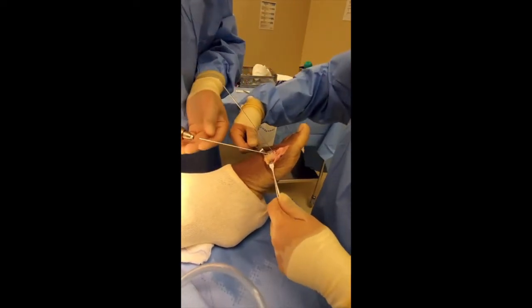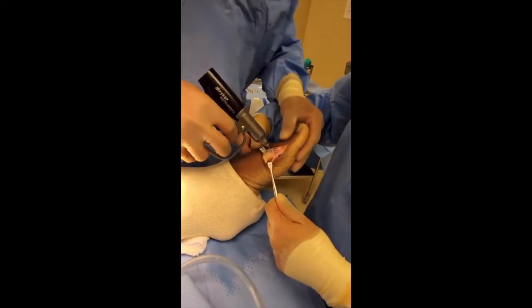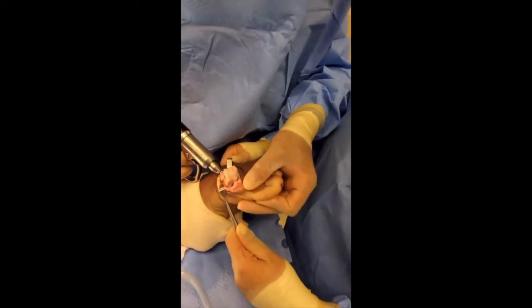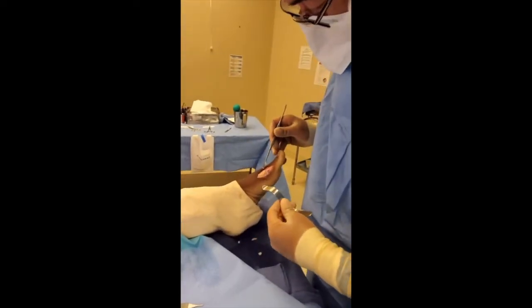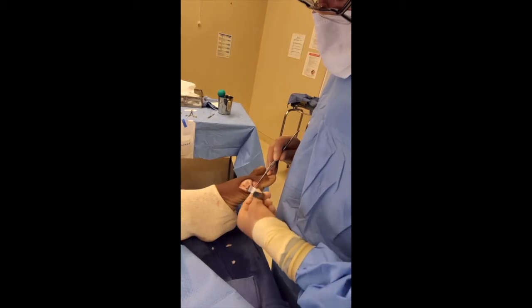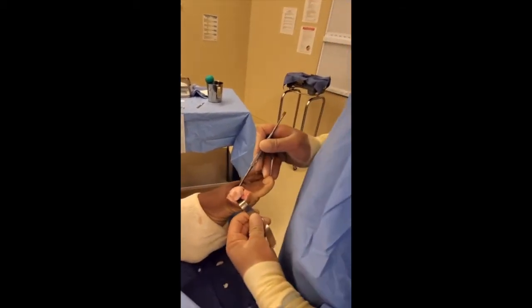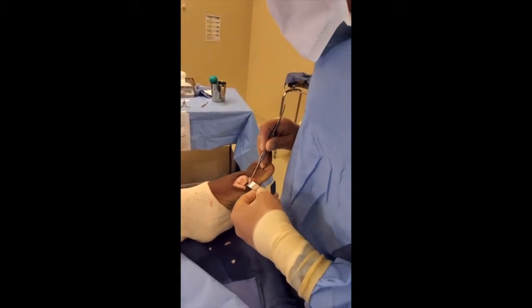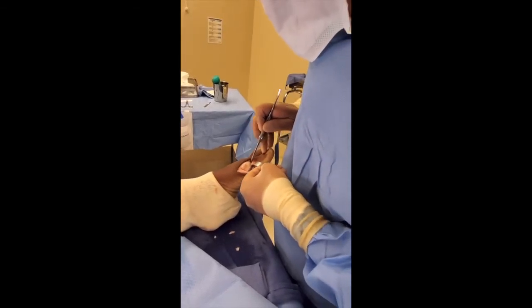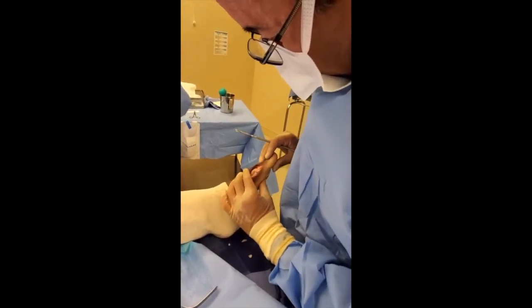Now we're going to remove the pins and clean up the bone. I always like to double-check — when I pull the bone out and look at the bottom, the screw is not coming out of the bottom; it stops just before it. We just got done polishing up the bone. You can see how nice and smooth that looks all the way around compared to what it was looking like before. The opposite side of the joint also is nice and smooth, and we smoothed all the bone fragments around that side too.